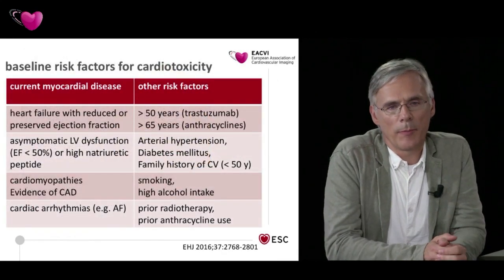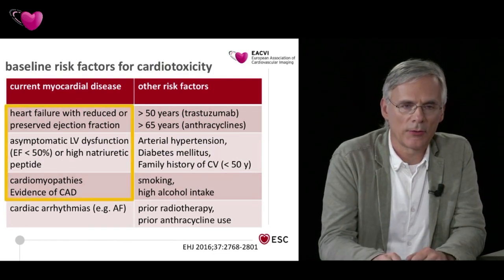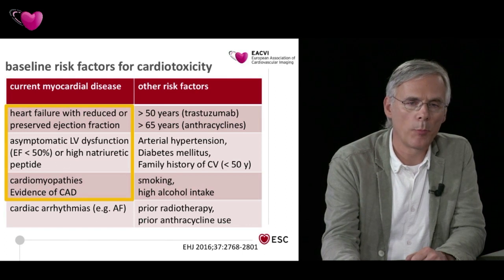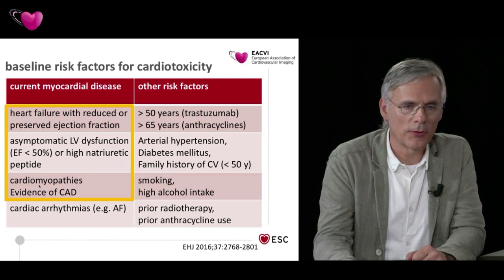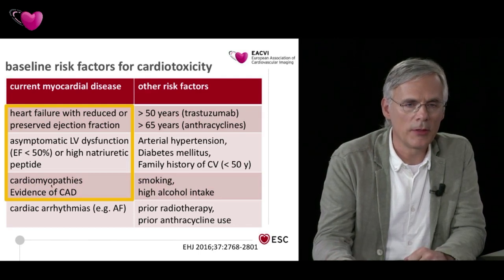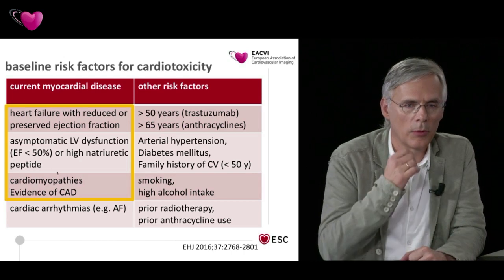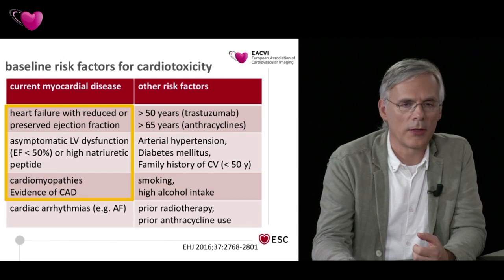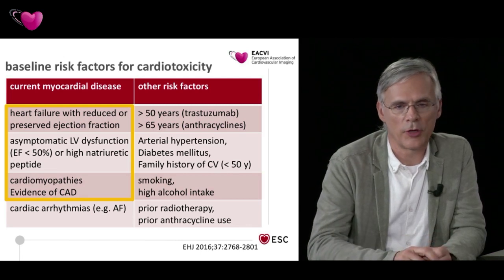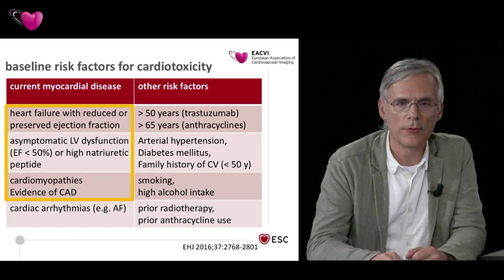If we look into the baseline risk factors for cardiotoxicity, there are some points we can diagnose with echo. We can look for scars as evidence of coronary artery disease. We can diagnose cardiomyopathies. We can diagnose asymptomatic LV dysfunction and, of course, heart failure, even with preserved ejection fraction. So echo plays a major role in imaging those patients.